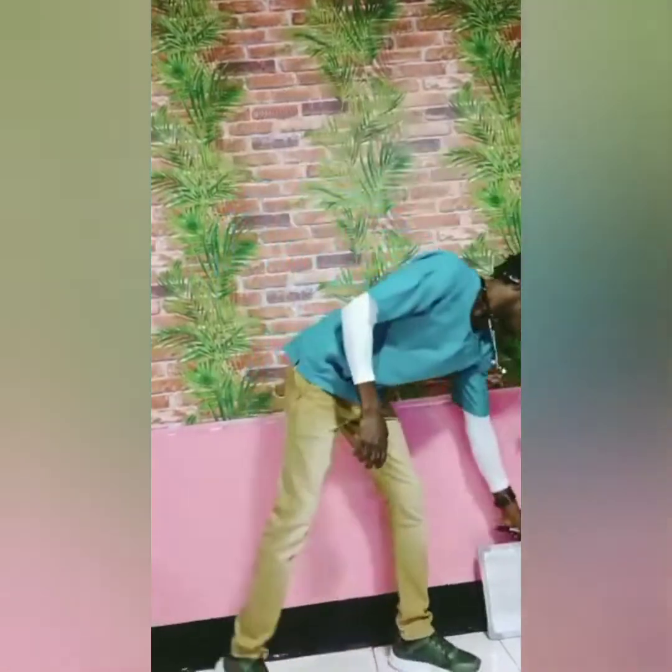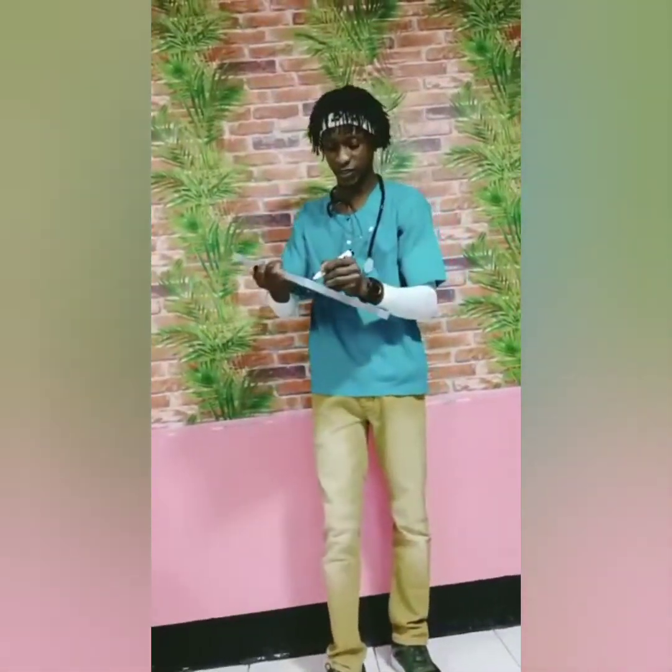So for blood pressure, there are two numbers that we register, or two sounds that we want to hear. The first sound and the last sound. Now, when I say sound, I don't mean musical sound, I mean Korotkoff sounds. These are the sounds that you hear, and you call them Korotkoff sounds. So what's the first sound?